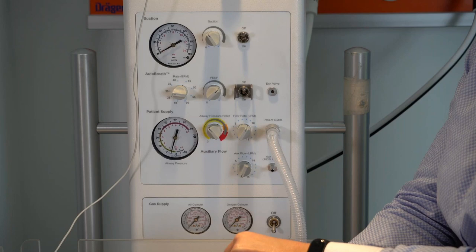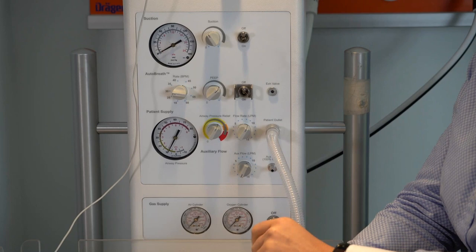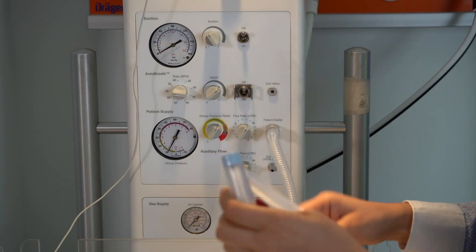So we recommend to start at 1 o'clock and see if this is sufficient for your baby, or sufficient for this particular patient. And if not, then you can change the adjustments. So the T-piece resuscitation circuit is quite simple. It only consists of a single limb.